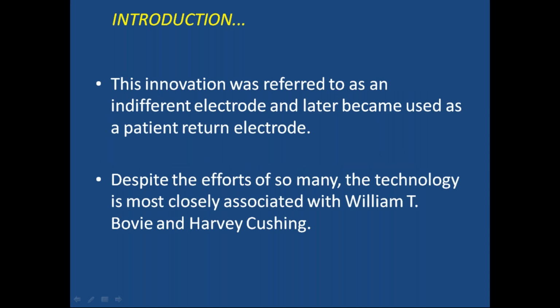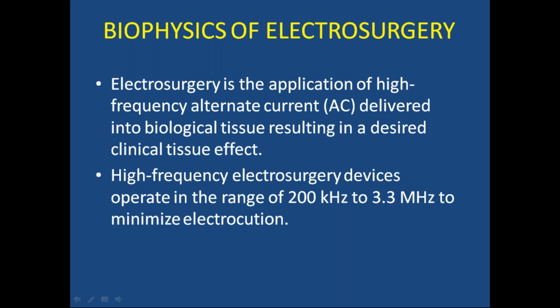This innovation was referred to as an indifferent electrode and later became used as a patient-return electrode. Despite the effort of so many, the technology is most closely associated with W. T. Bovie and Harvey Cushing. So biophysics. We cannot escape from these topics because these are must-knows in surgery. So these are the important questions also.